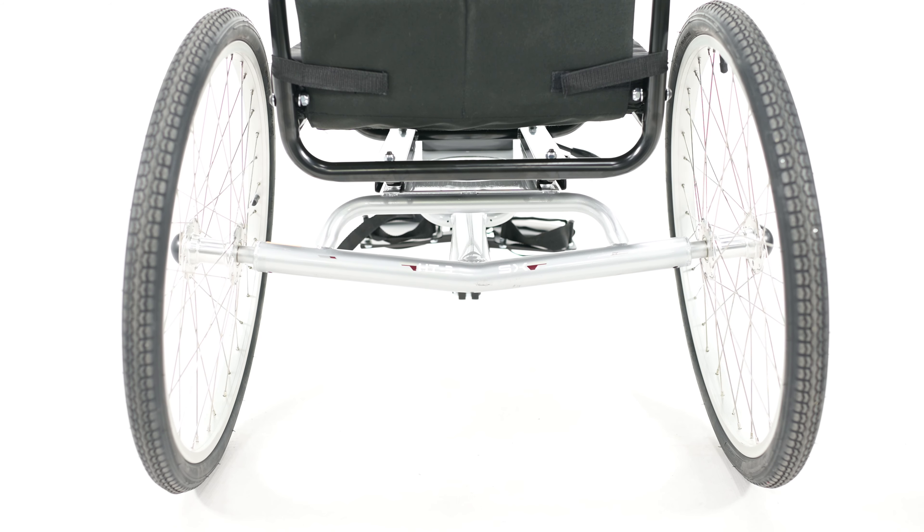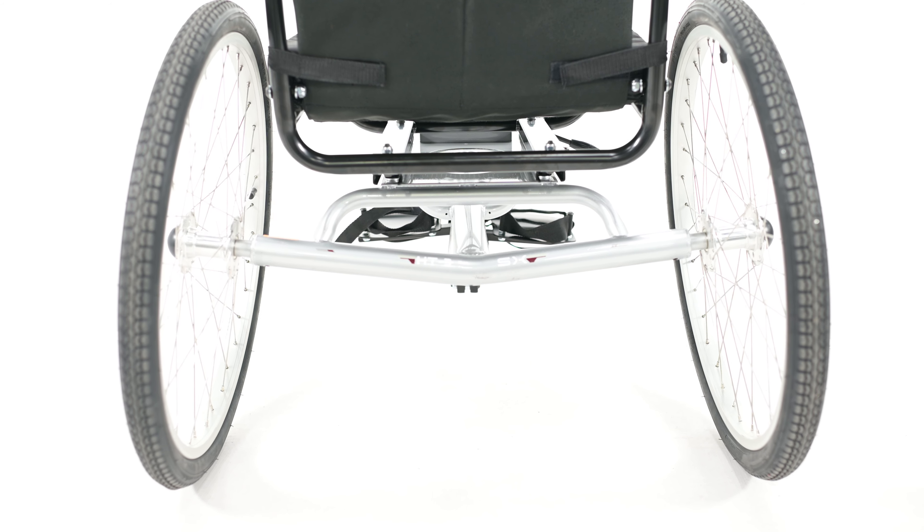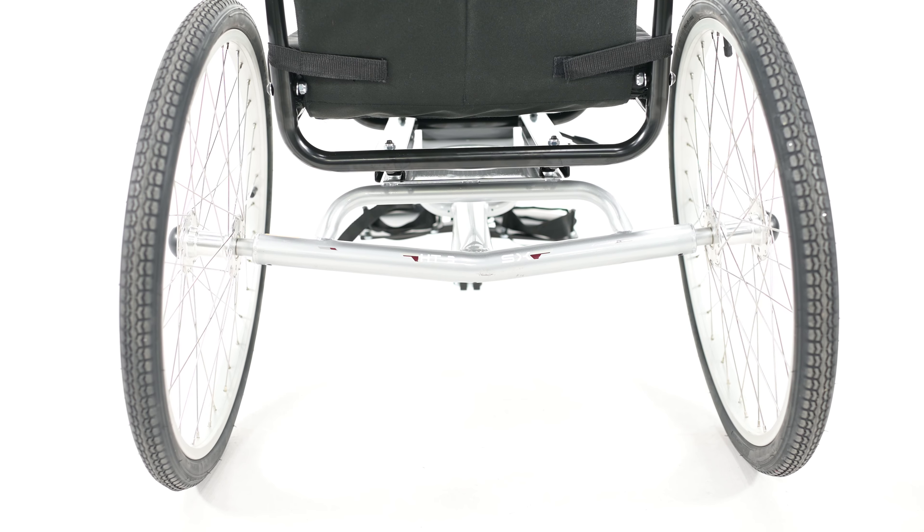It has 24-inch wheels all around, and the two cambered rear wheels in addition to the long wheelbase help make this trike incredibly stable.